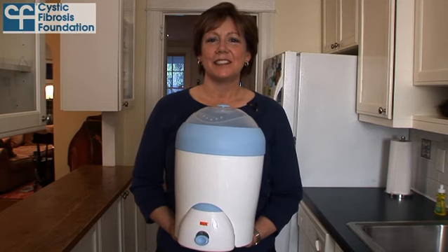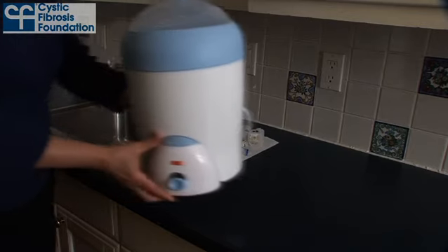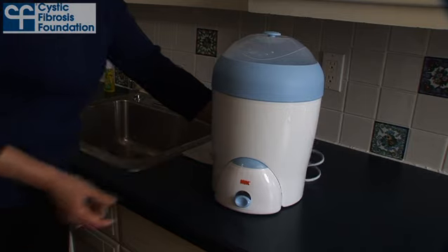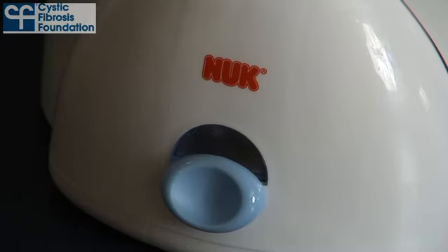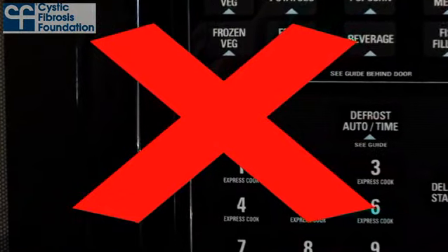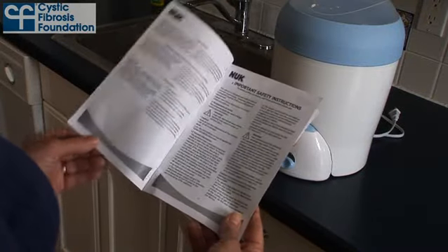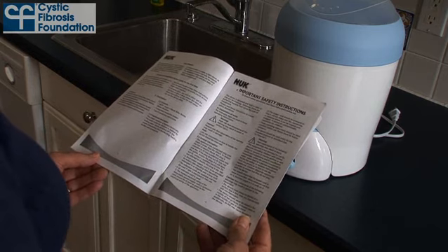The next step is to disinfect your handset using an electronic steam sterilizer like those used for baby bottles. For this demonstration, I'll be using the Nook Quick and Ready Baby Bottle Steam Sterilizer. Do not under any circumstances use a microwave steam sterilizer, and be sure to read the operating and safety instructions before using your baby bottle sterilizer.